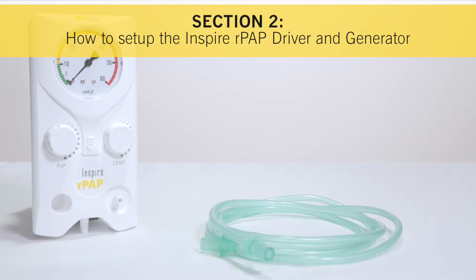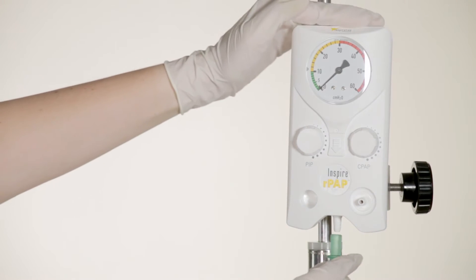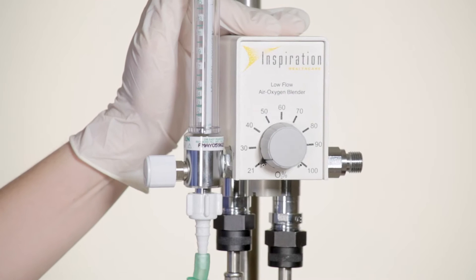How to set up the Inspire RPAP driver and generator. The first step in the set up process is to connect the RPAP driver to a blended air and oxygen supply. To do this, connect the oxygen tubing to the gas inlet port on the driver and connect the other end of the oxygen tubing to the flow meter.